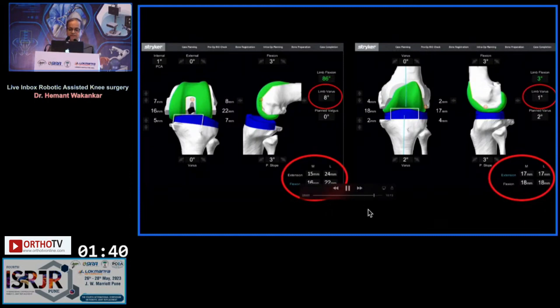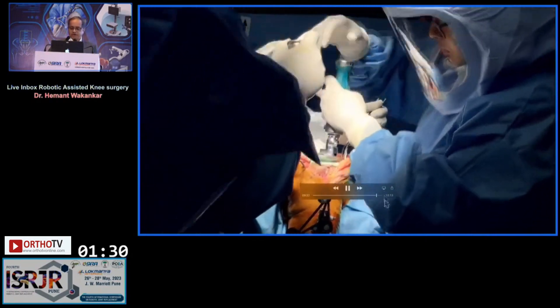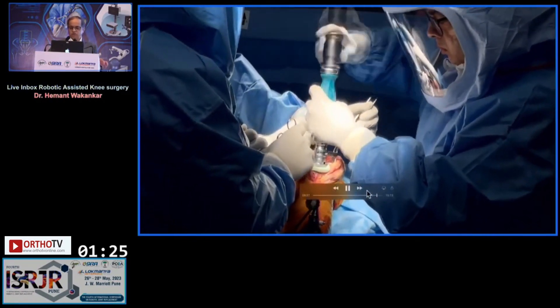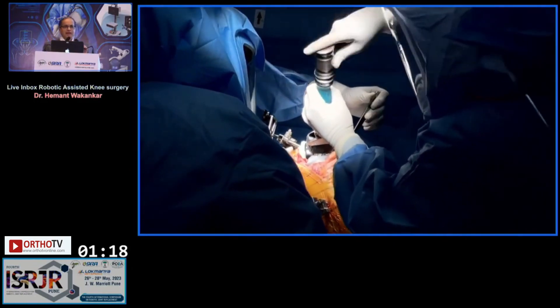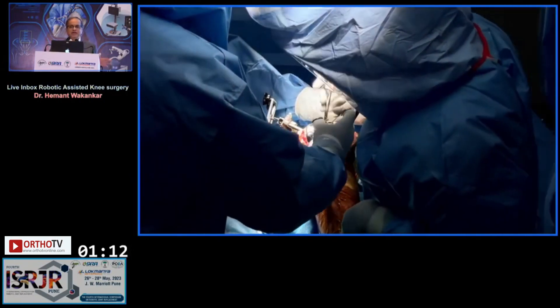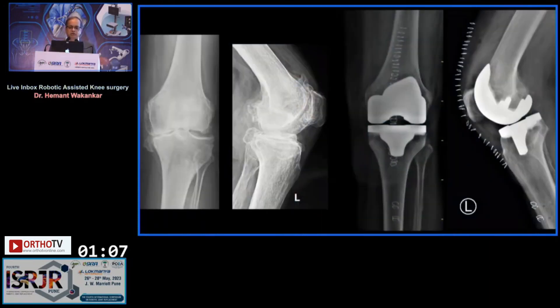What remains next is the pulse lavage, cleaning everything up, and the cementation. You can check again at the end of implantation using the same screen. So practically, that is the end of the surgery. It gives you the satisfaction of virtually planning your gaps and balancing before you have done any resections. One thing you realize is that you significantly resect much less bone on both the tibial and femoral sides, depending on the laxity. And that is the postoperative x-ray of the same patient.